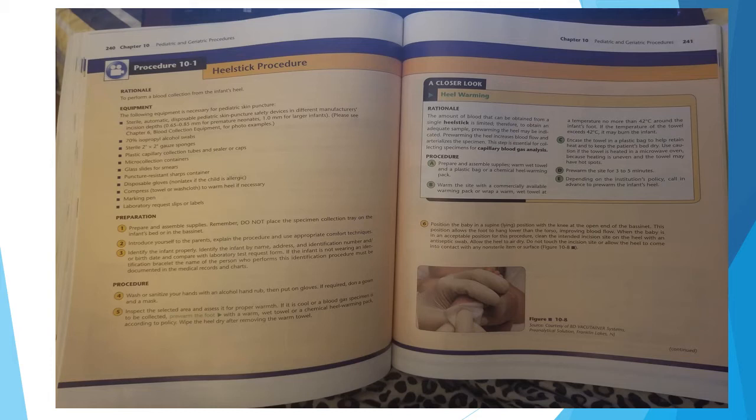Heel warming. Rationale: the amount of blood that can be obtained from a single heel stick is limited. Therefore, to obtain an adequate sample, pre-warming the heel may be indicated. Pre-warming the heel increases blood flow and arterializes the specimen. This step is essential for collecting specimens for capillary blood gas analysis.